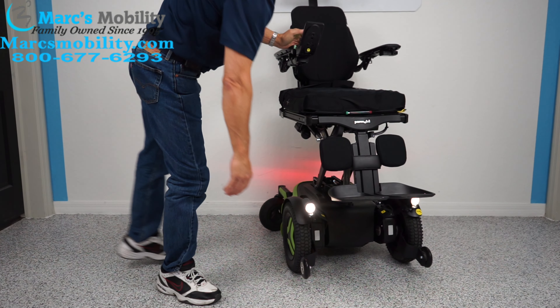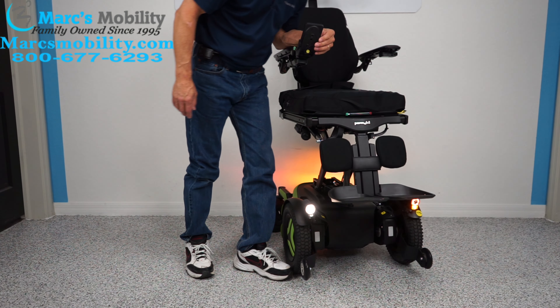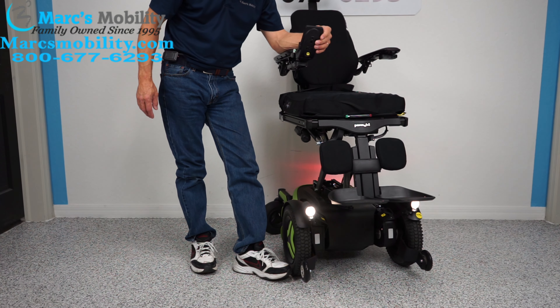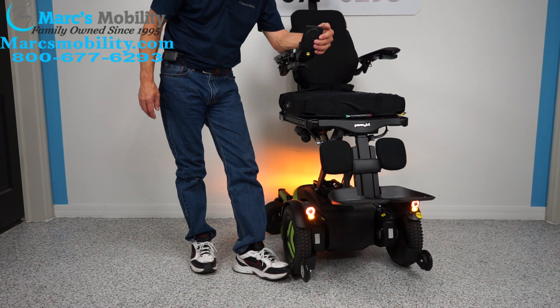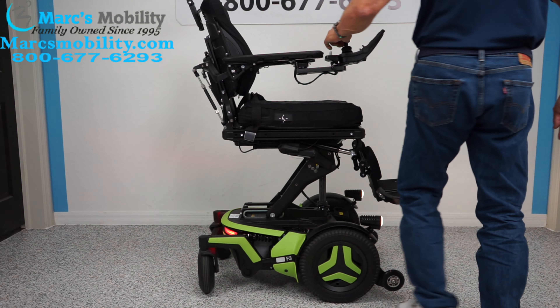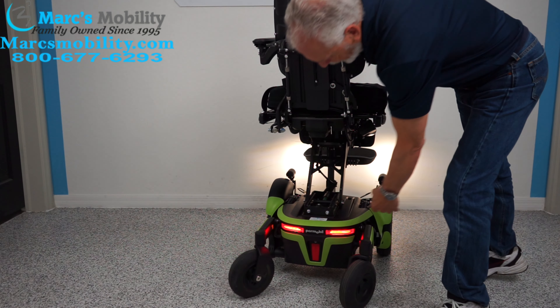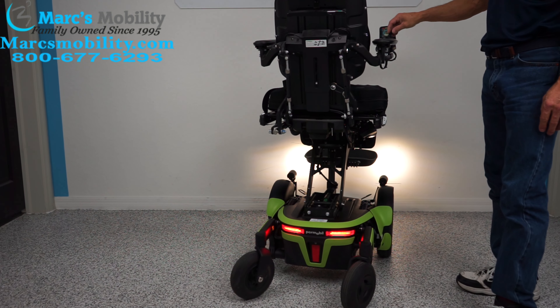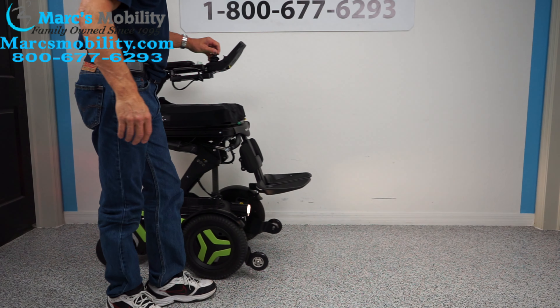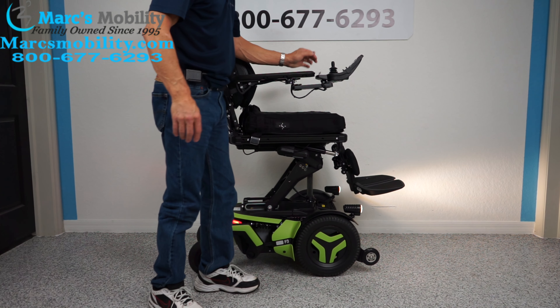These are actually real lights, and they also have flashers. So you have flashers there, flashers here. You have hazards, and of course you have the headlights, and you have the same thing in the back. This chair is equipped with the Permobil factory lights all the way around. Let's turn the lights back off and put the chair back over here.